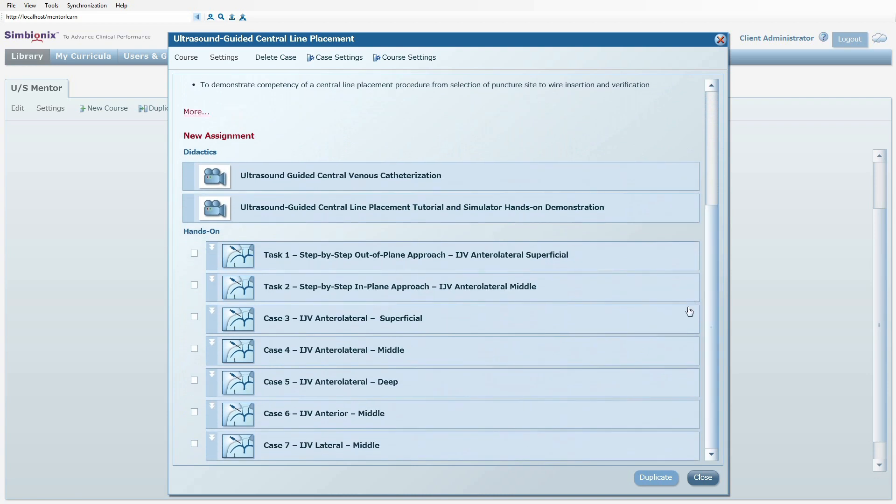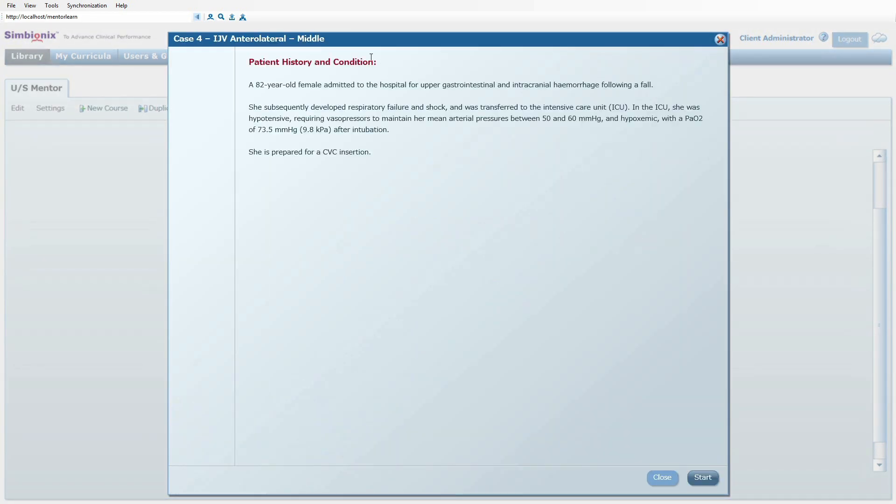Educational tasks for step-by-step ultrasound-guided procedures, both out-of-plane and in-plane, and clinical cases varying in internal jugular vein position relative to the artery and depth are included. Each case starts with a patient file for the trainee to review.